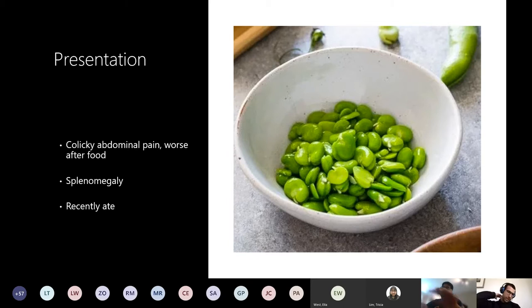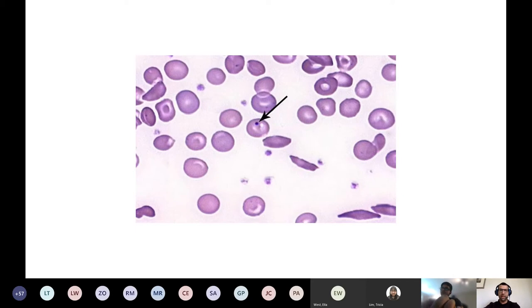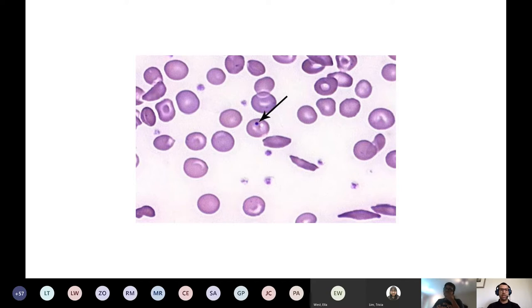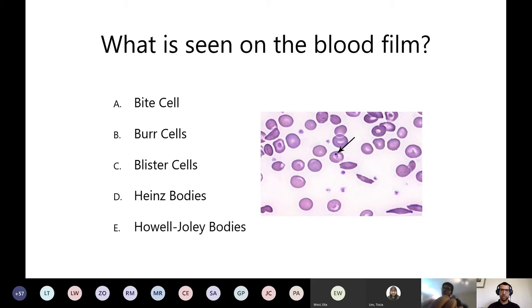Next presentation: someone has colicky abdominal pain worse after food, they have splenomegaly, and they recently ate these particular foods. Here is their blood film - the arrow is pointing to a specific finding. What is the abnormality? Is it A: bite cells, B: burr cells, C: blister cells, D: Heinz bodies, or E: Howell-Jolly bodies?